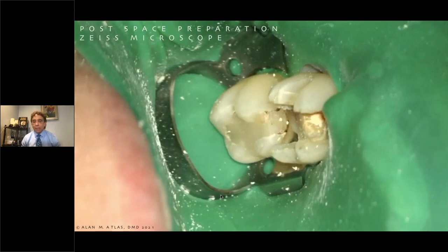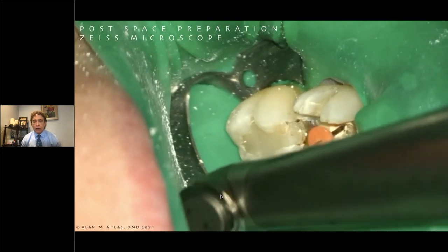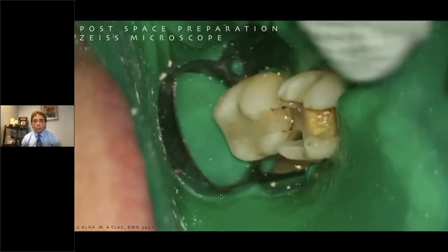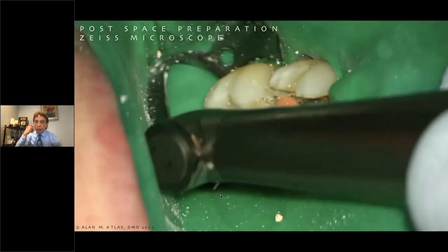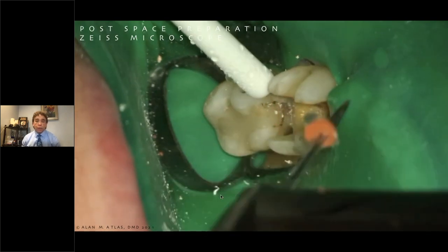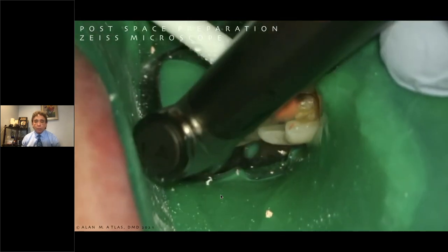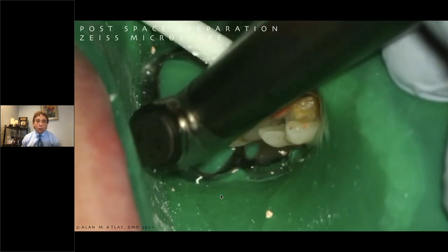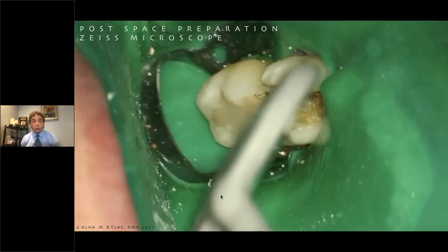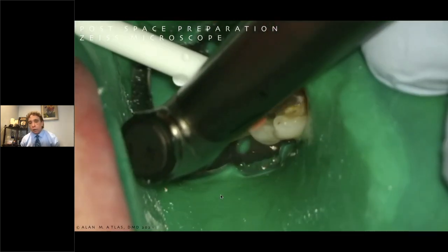This is placing a post-space preparation on a molar. This is a dentist that came to me to have me do this. Wanted a post in the canal, felt more comfortable, and because the patient was a dentist, I said, okay, would I necessarily have to put a post here? Well, after preparing the tooth for an overlay or an onlay or crown, probably not. I think there was a lot of tooth structure available, but nonetheless, it doesn't hurt. The only thing is it just takes a little bit more time. The endo was done. Patient came to me with the endo done. And again, we may choose to do this a little bit differently going forward.